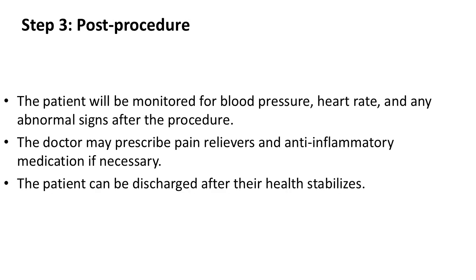Step 3: Post-procedure. The patient will be monitored for blood pressure, heart rate, and any abnormal signs after the procedure. The doctor may prescribe pain relievers and anti-inflammatory medication if necessary. The patient can be discharged after their health stabilizes.